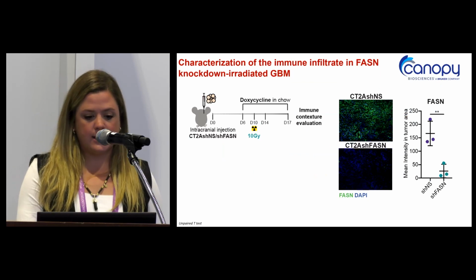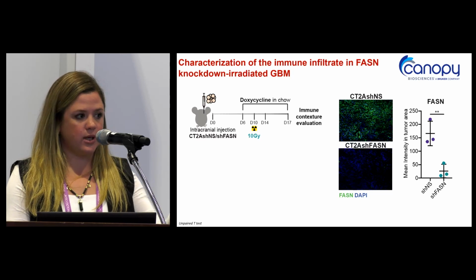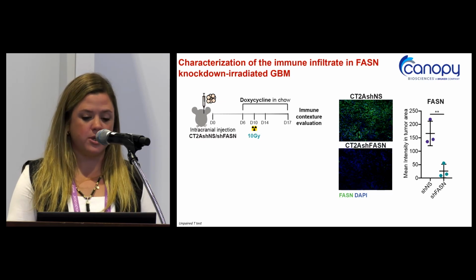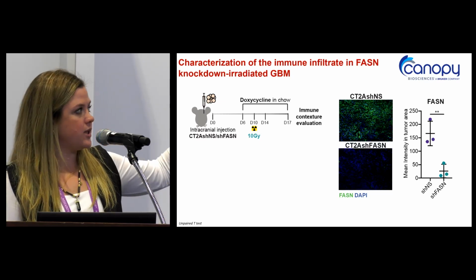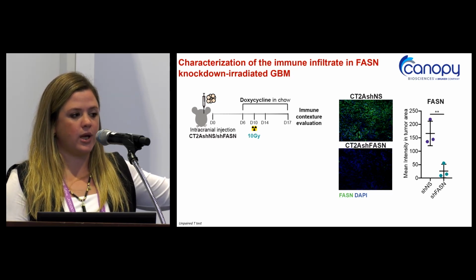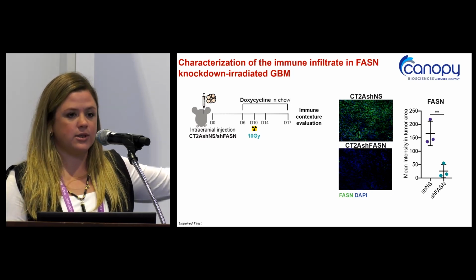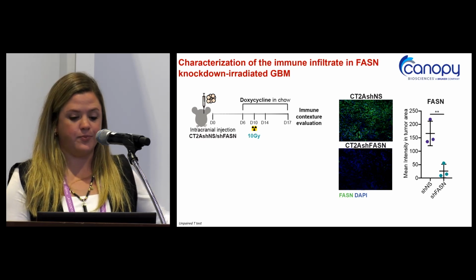To test this hypothesis, this is where Canopy comes into place. We applied to the pilot award, which allowed us to analyze 4 samples. What we did was inject CT2A cells that had a doxycycline-inducible construct, with either a non-targeting sequence, so shRNA non-silencing, or an shRNA against FASN.